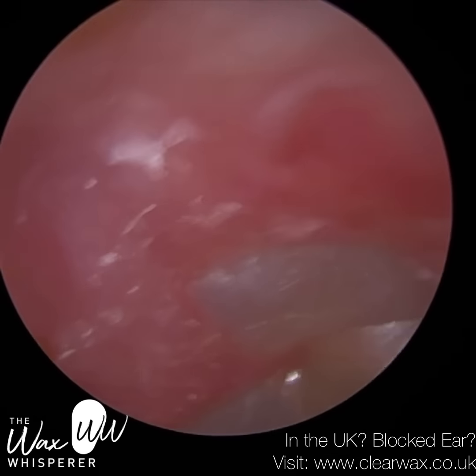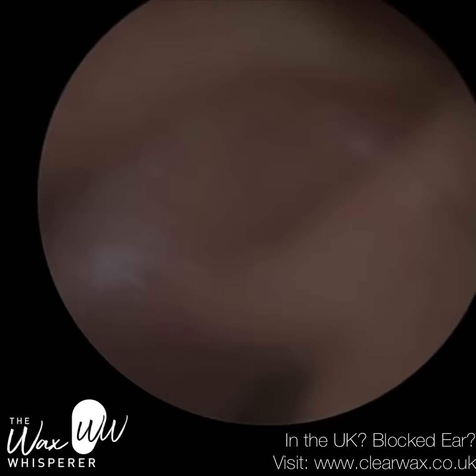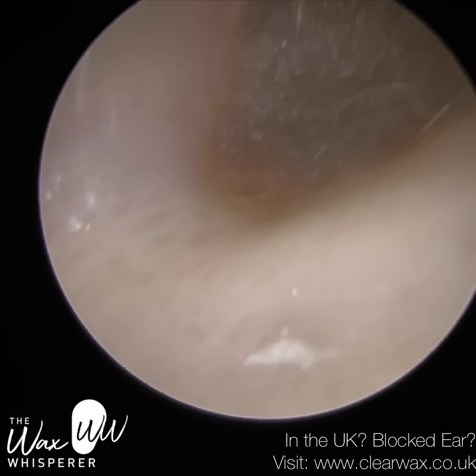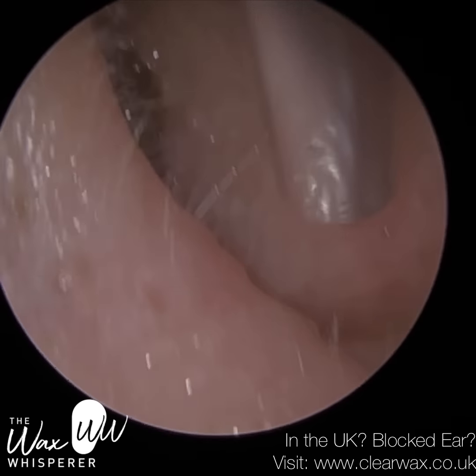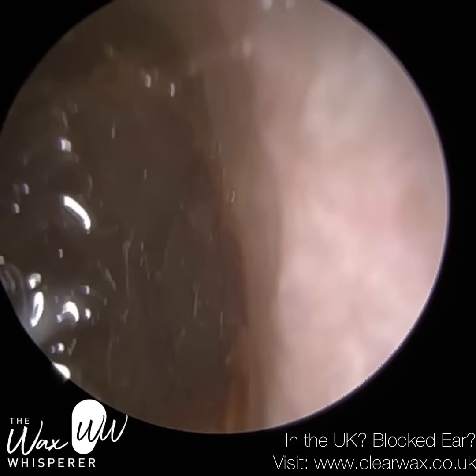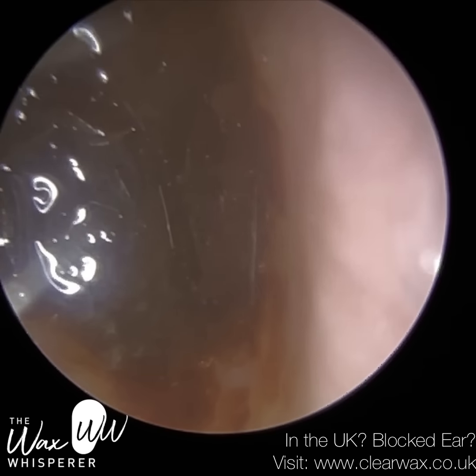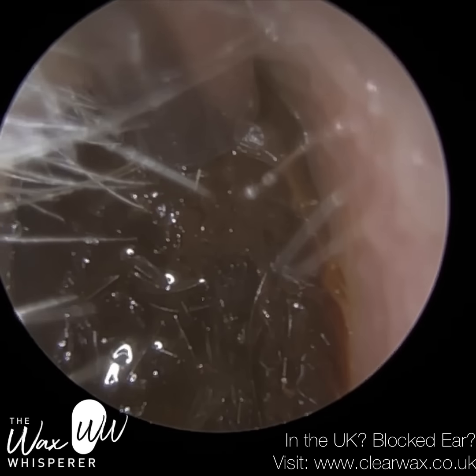You can see that. Hopefully you can see that widening, just where I'm angling there. So I got that one out, and that was their worst ear. So we looked at this and we looked at each other and thought, do you think it's going to take us long? And I was pretty confident this wouldn't take us long. In fact, this took about 5 minutes, if that. I immediately put some sodium bicarbonate drops in.